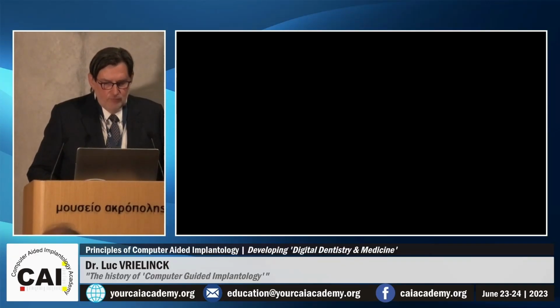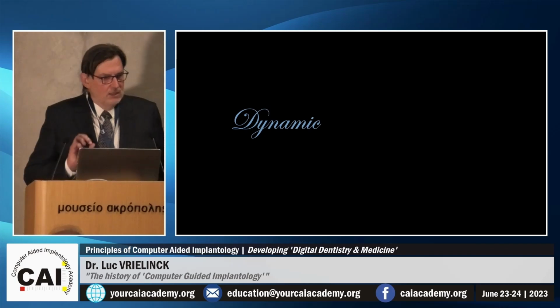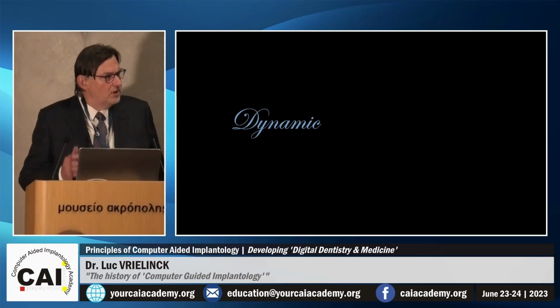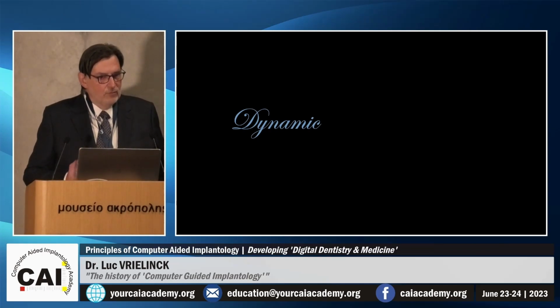What about the future? Just a few ideas. Because you have been so long in the past, we are allowed to think about what the future will give. We started with static guiding. Drill guide is an example. So we are evolving to dynamic guiding, to navigation techniques, maybe to robotic surgery. And actually, if you think profoundly, a robot is a combination of static and dynamic. It's both together. So it makes sense. It's a logical evolution.